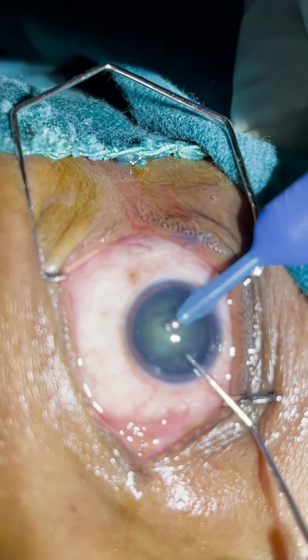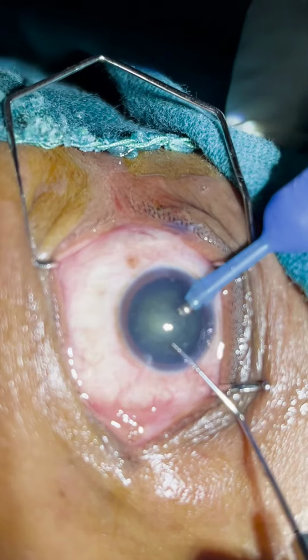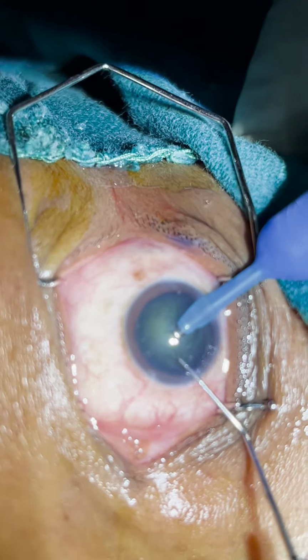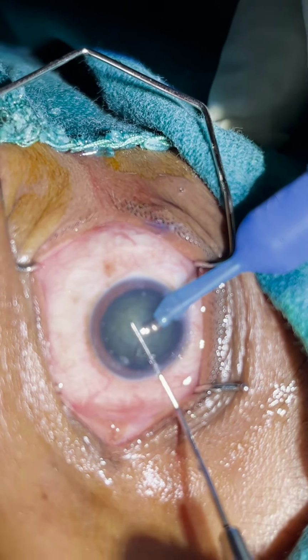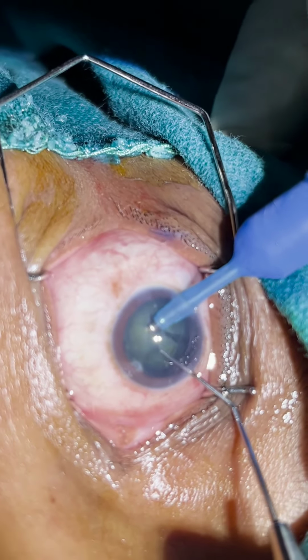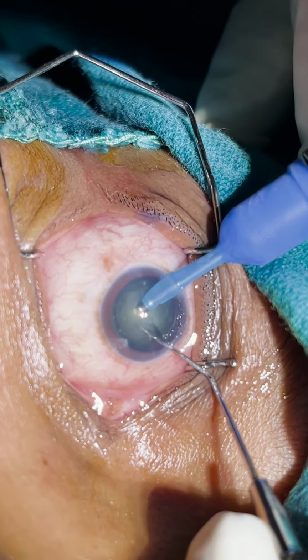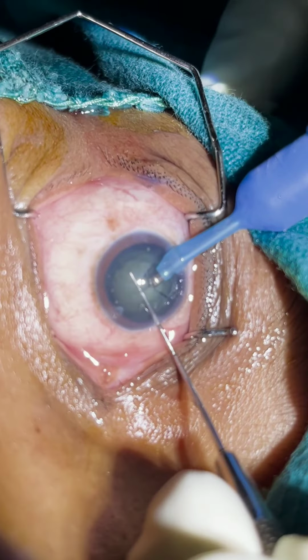Using very minimal power, I'm just aspirating out the superficial cortex. Now I'm giving a small groove, and after that I go to phaco. Now we'll try to have a direct chop. See how nicely it got divided. When we are getting a grip, even for soft cases, it's always better to do the direct chop technique than flip and chop.